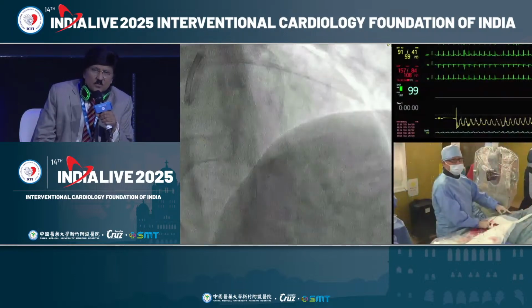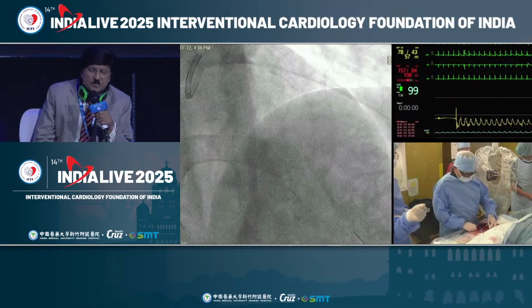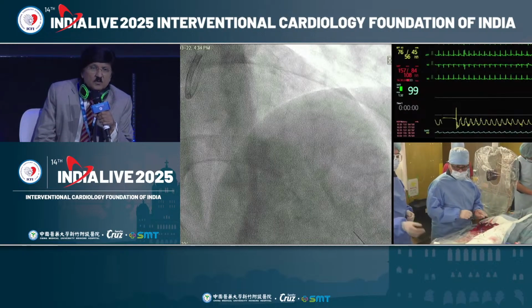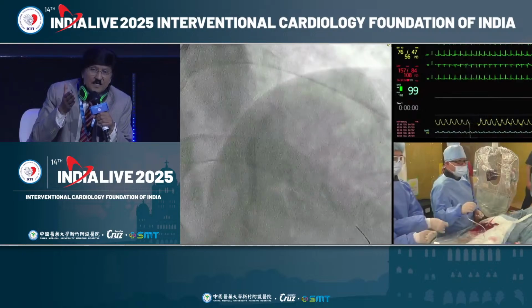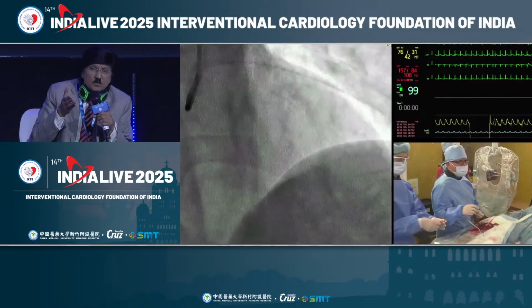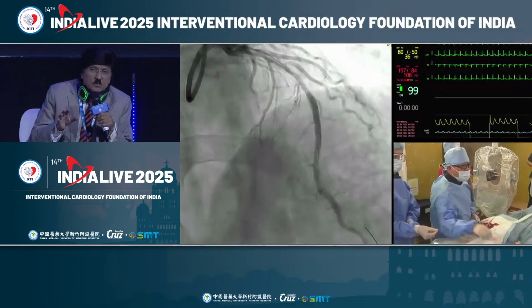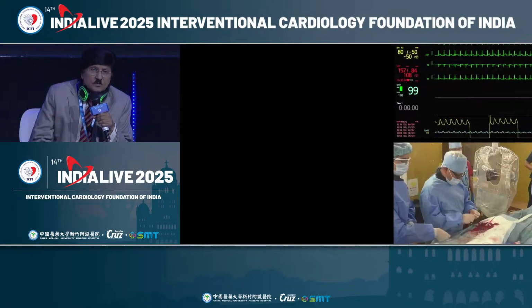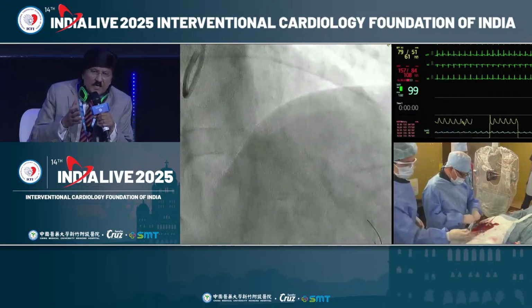I think I have seen some amount of hypotension also, maybe slow flow also. In the perfusion fluid, do you add nitroglycerin there? No, nitroglycerin is for large vessels, middle to large vessels, so I always use nitroprusside. What about nicorandil? Do you use nicorandil?